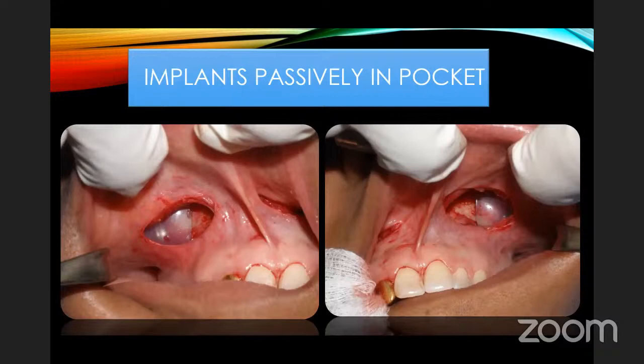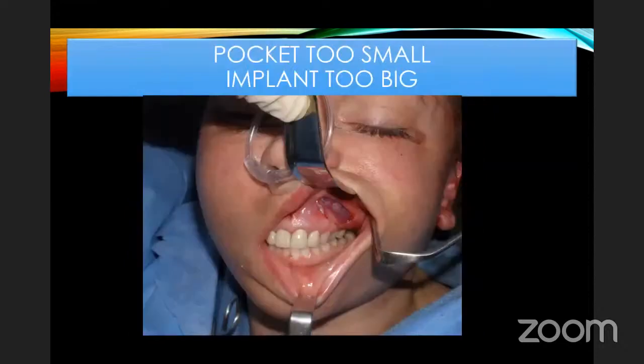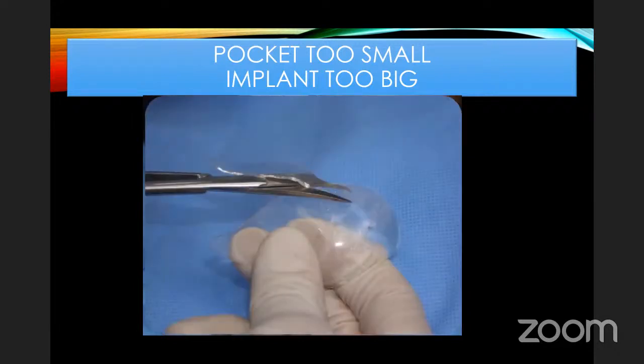So here's a patient where the implants are placed. And this is an area where some people would just close with sutures, but I always use screw fixation. So after I put the implant in, I'll pull on the lip and press on the cheek to make sure that the implant does not slide out of the incision. If the implant protrudes, then I need to either trim the implant or make the pocket bigger. And one of the nice things about silicone is it's very easy to trim and shape.